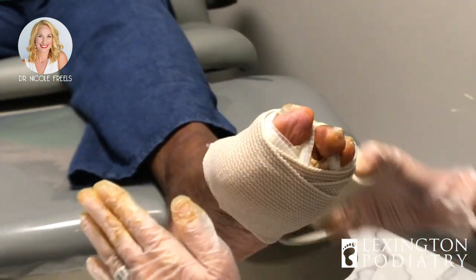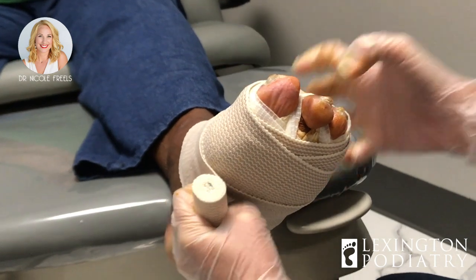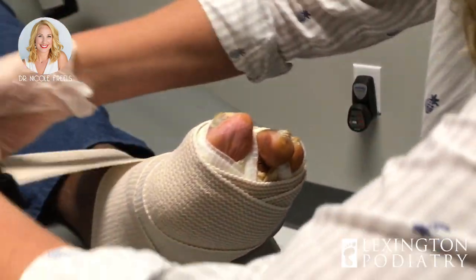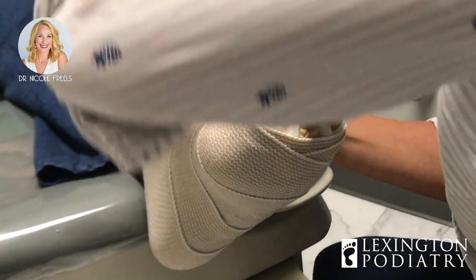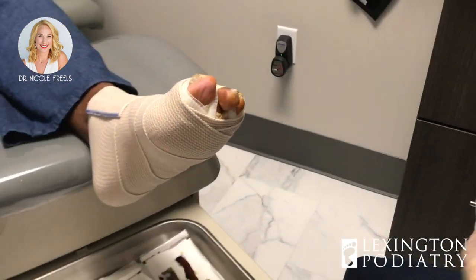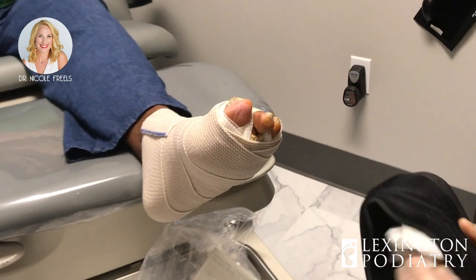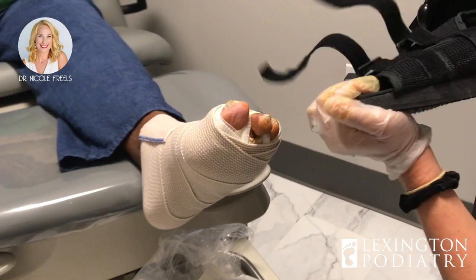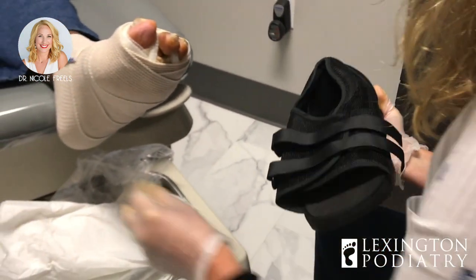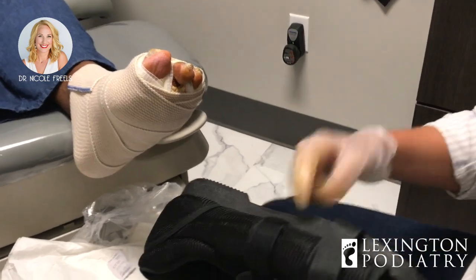Anytime we're doing any type of foot surgery, we always want to make sure we start closest to the toe and then work our way back. That's going to help prevent any swelling being trapped down towards the tip of the toes, which can be very painful. You don't need a boot or anything crazy — we're just going to get you in this simple hard sole post-op shoe. This helps prevent any motion from the shoe. When my grandfather was a podiatrist they even had wooden post-op shoes — that's how important it was not to have any flexibility in the sole.